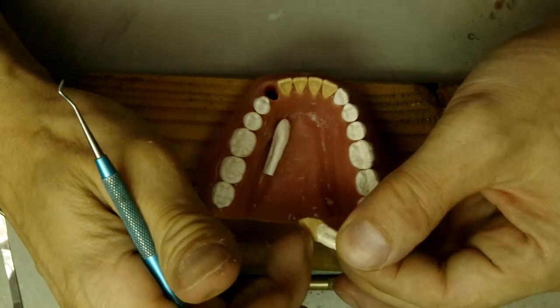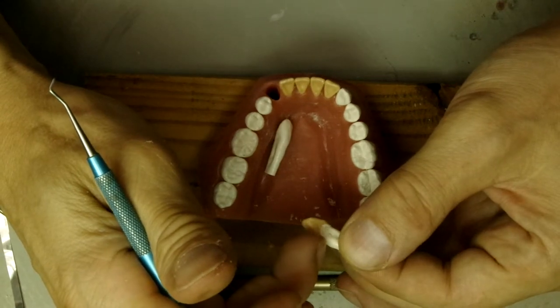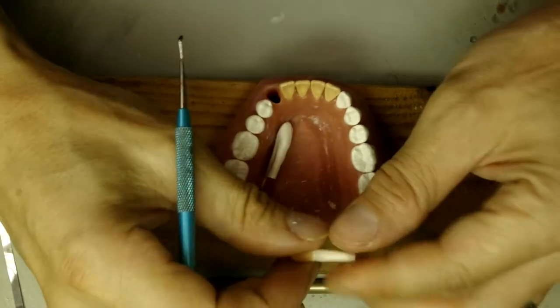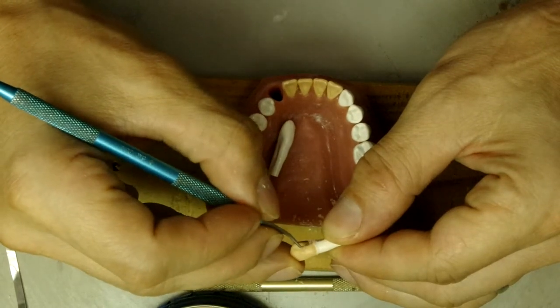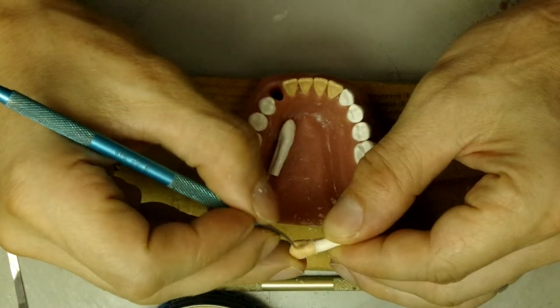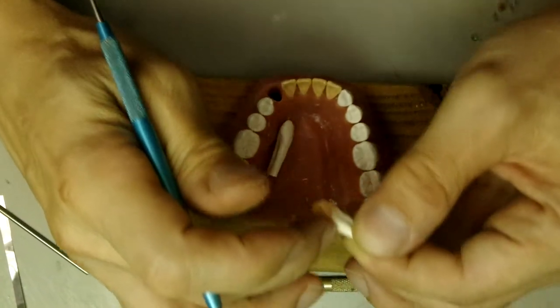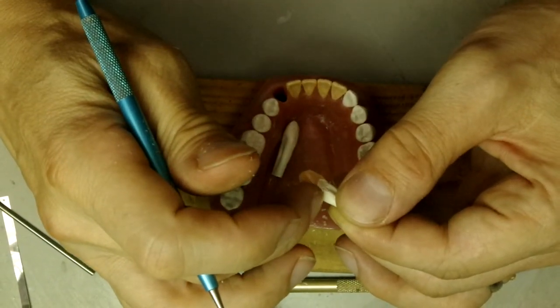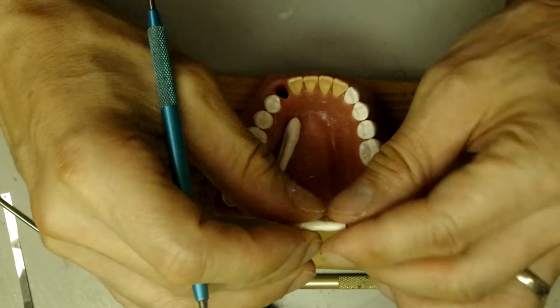So just use your nails. If you can feel the line, then it's not right. So then you gotta add a little more and then take it back very slowly until you run your finger along the margin and you don't feel the transition of the wax and the die.